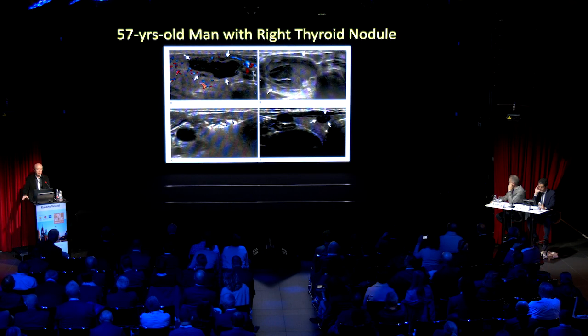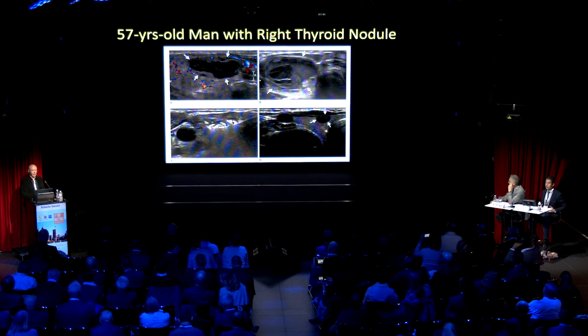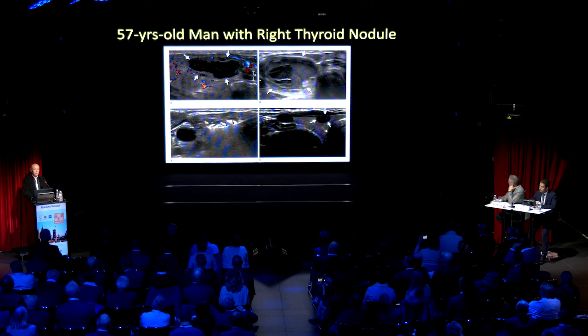And in this second case, Professor Baek used a different technique. This was a mainly cystic or pseudocystic thyroid nodule with a fluid component, but after drainage, he observed bleeding inside and treated the patient with ethanol, and after ethanol, radiofrequency. The eventual result in panel D is the permanent cure of the patient.